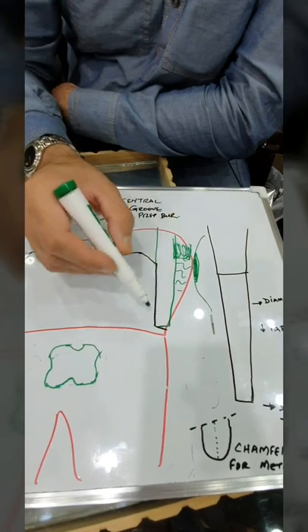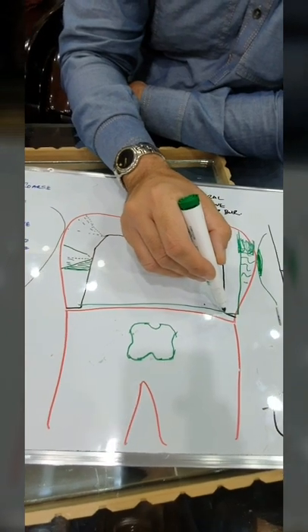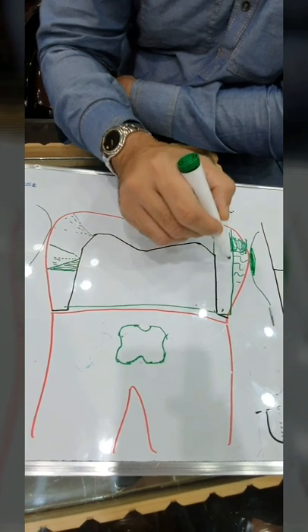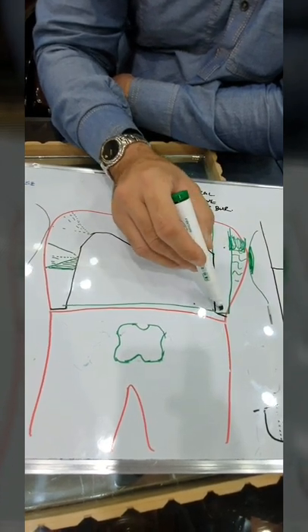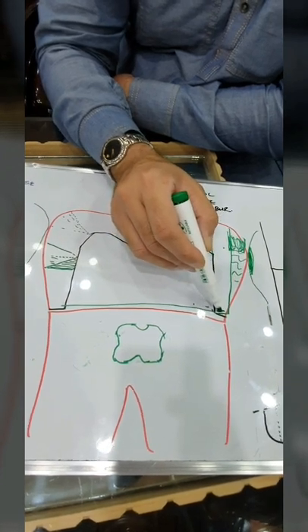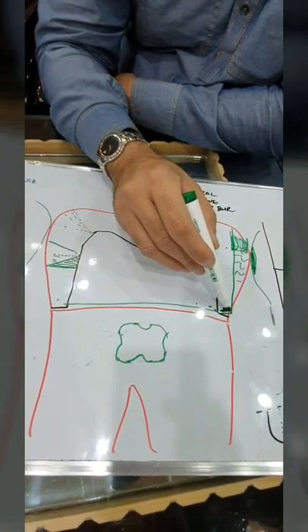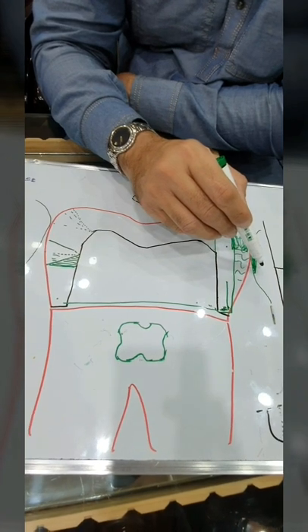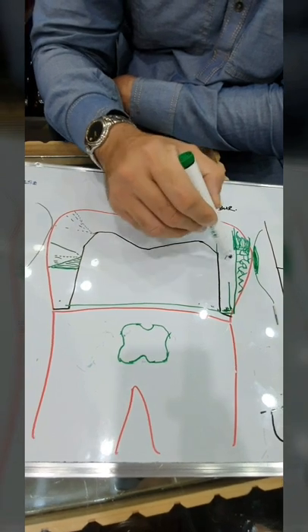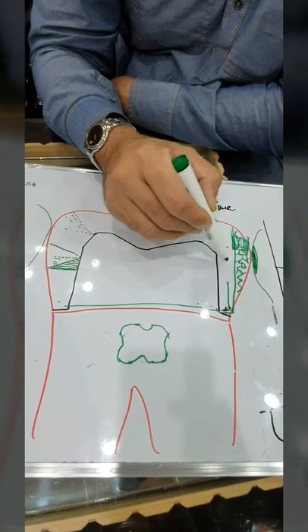My cue for that is you prepare the facial margin completely, and from facial you keep the same margin depth, you start going interproximal. And not high up occlusally, but from a gingival point of view. And if you start cutting at the gingival level to continue the facial margin into the distal sulcus or the mesial sulcus, you will be able to do a nice prep without nicking the adjacent tooth, and you will start seeing that there's a sliver or a piece of enamel still left beyond the width of your burr, even at the widest point. That's the way to save that.